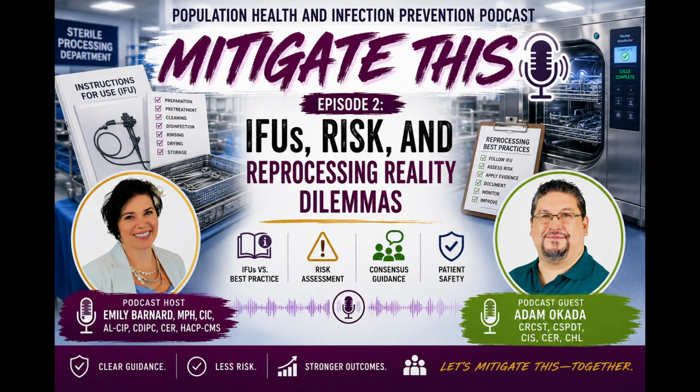So I would always be skeptical if somebody's saying, well, it's not in the instructions for use, but you can still do it that way. And don't take sales reps' word for it either. We have sales reps that work at HealthMark, and I love them to death, so I don't think we would do that at HealthMark for sure. But I have heard reps in the past say things like, oh, you just sterilize that on a standard cycle, 4 minutes, and then I'll go to the IFU and it'll say 5 or 8. The instructions are different from what the sales rep is saying. The sales rep is trying to make it as easy as possible for you, not necessarily telling you what you need to do.